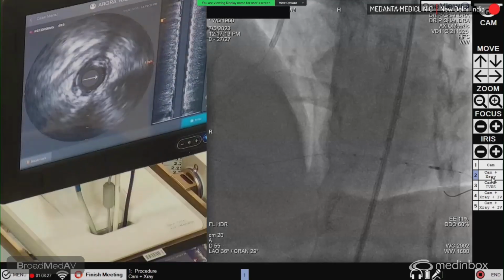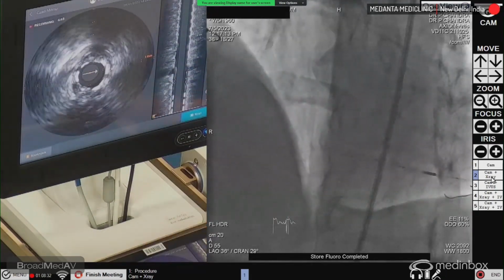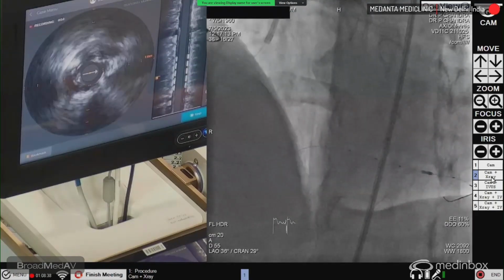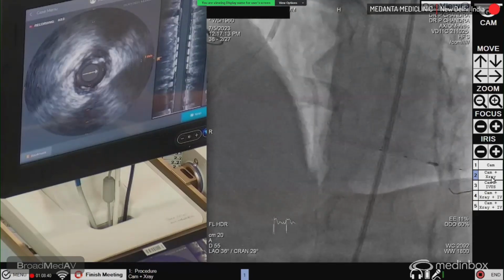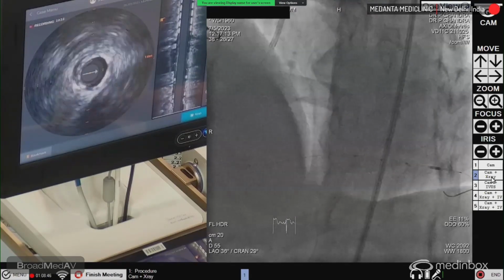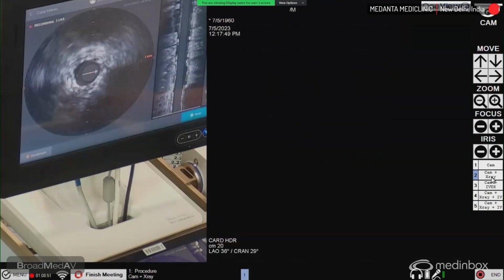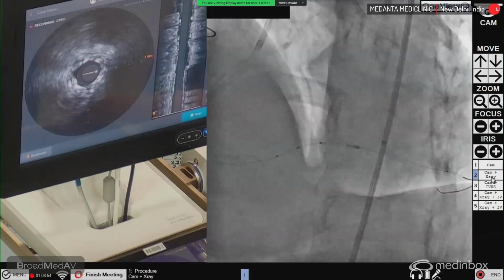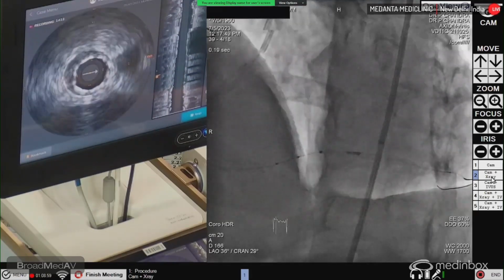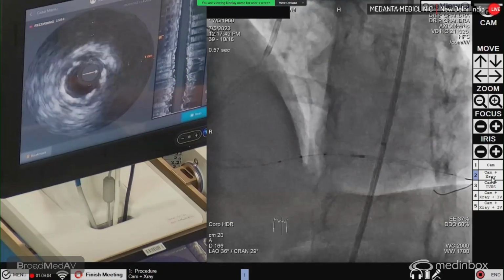So yeah, there is some plaque here. Yeah, now the stent is quite good. Well expanded. There is no distal dissection. There's some disease there, or in any case, little plaque there. We might like to put one small stent there. 2.5 into 8. Otherwise, it is expanded, but here we can expand more. We can go to higher pressures. Yeah. But proximally, it is very good. Proximally, the stent is very well expanded.